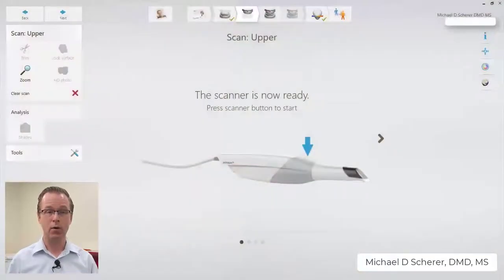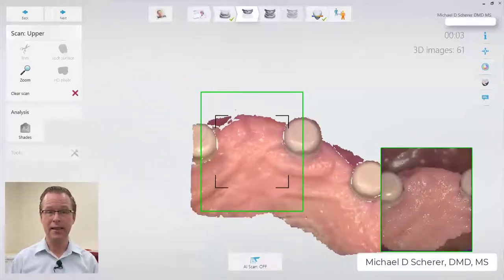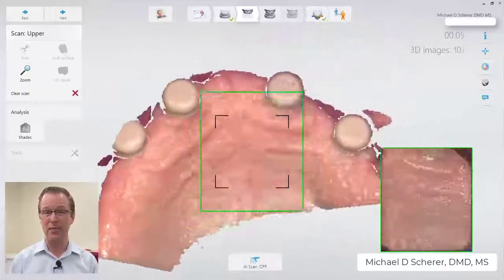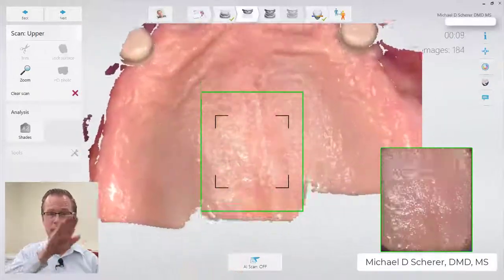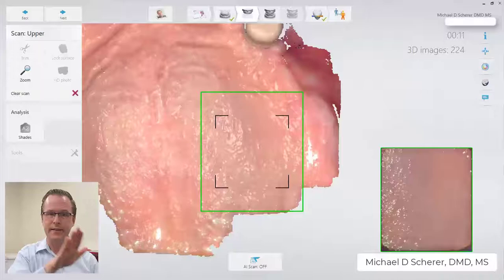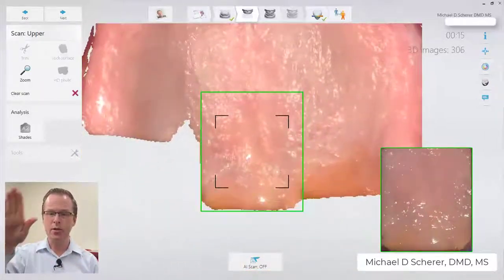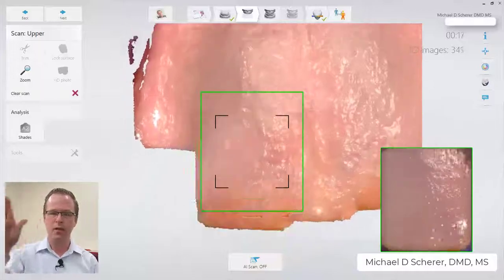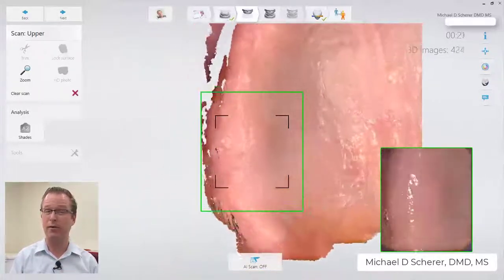Once we have our intraoral scanner set up, we take it directly to the mouth. We begin by scanning on the pre-maxilla area of the maxillary ridge. This area has a lot of rugae and good anatomical structures that allow the scanner to lock in. Then I do a bobbin weave motion as I go further back onto the posterior aspect of the palate, and almost a wax-on, wax-off type motion to pick up the area right around the vibrating line.